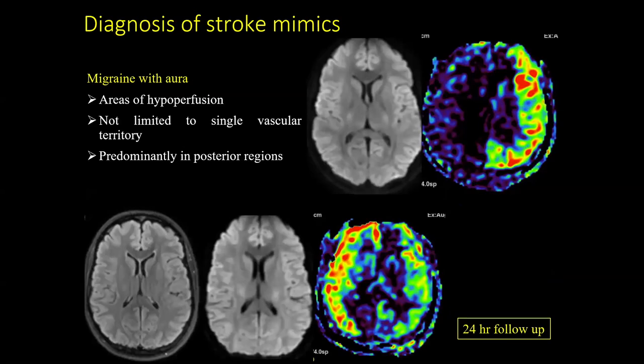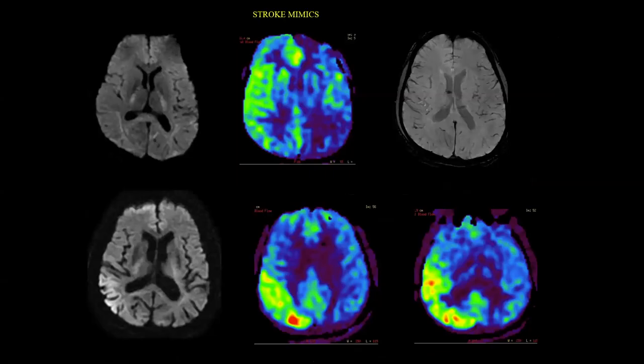Another example shows migraine with aura: a very large area of hypoperfusion not limited to a single vascular territory and predominantly posterior in distribution. On 24-hour follow-up images, there is complete restoration of perfusion. Many times we see Todd's paraparesis or postictal status where patients present with stroke-like symptoms, and ASL helps us to confidently diagnose these mimics.